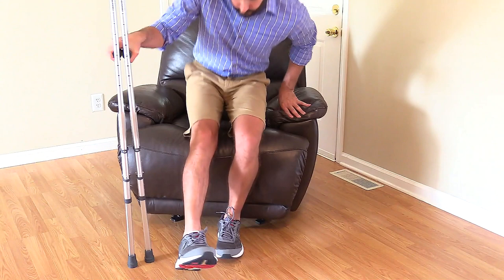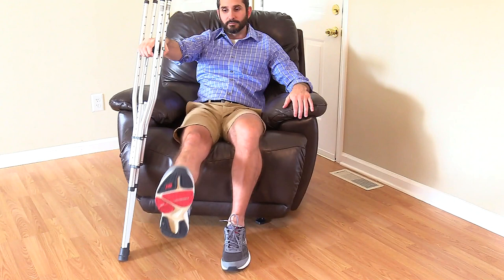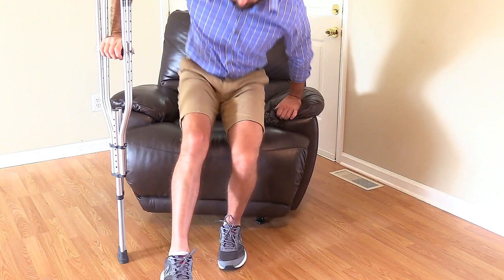To get up from the chair, the patient is going to take the crutches and put them on the injured side for support. He's going to keep the injured leg extended and push up on the non-injured side using the hand grips of the crutches. Then he's going to put the crutches in position.